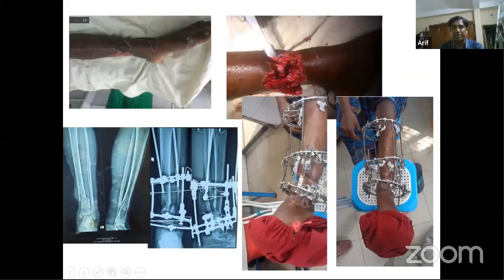Please keep in mind what the safe limit of this type of docking is. With this patient, we saved the limb with the soft tissue flap only on the posterior side. If you follow it very minutely, you can see that the limb circulation is going on only on the posterior side, and anteriorly there is just skin coverage. So this type of very difficult condition you can manage with this type of angulation and docking coupling.